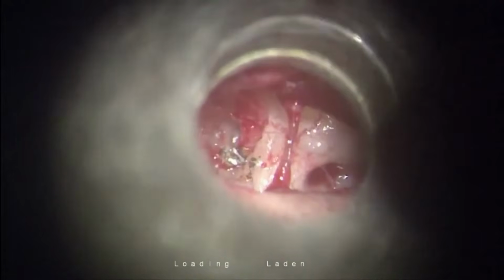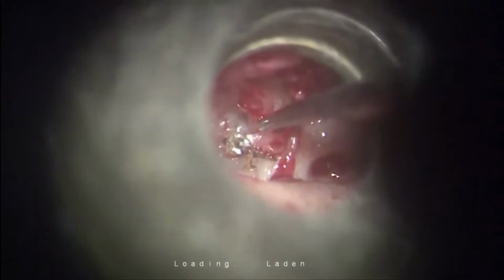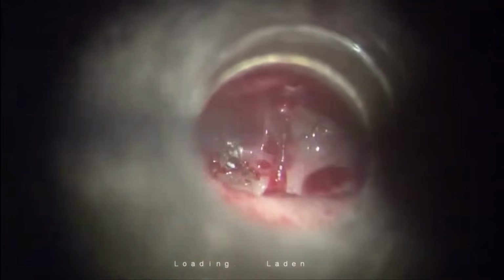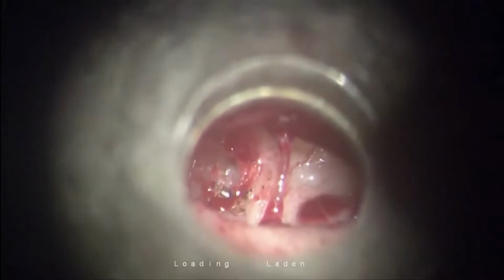See this? It is already broken. Yes, anterior crus is fragile, we know. I can break this and bring out the footplate, the stapes suprastructure, in no time. Can you see this? Yes, sir. Forceps. See, it is like a video game, you can say. That noise. It is like a video game.